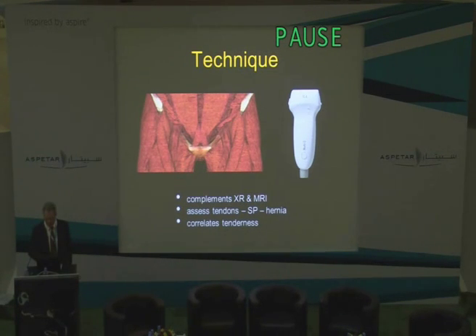The transducer I use to do this is a broadband transducer, but with a centre frequency of 7 or 7.5 megahertz.